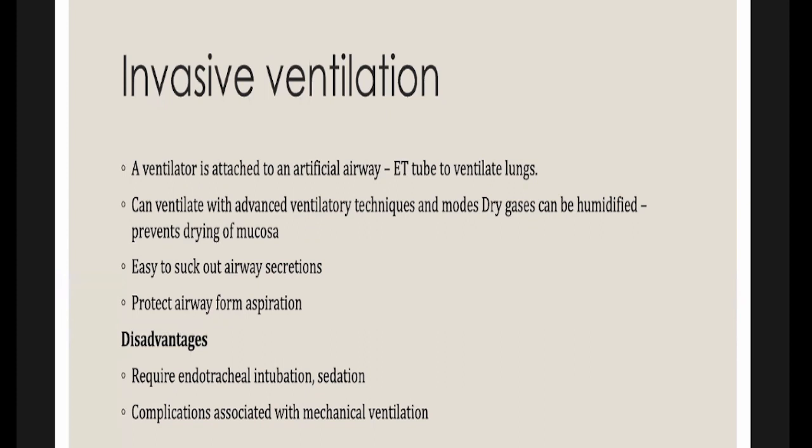So that's why we try to wean them from ventilators and take the ET tubes out as soon as possible. And also there are complications associated with mechanical ventilation, like pneumothoraces, chest injuries, and they can get barotrauma, volutrauma, atelectotrauma, and a lot of other problems. Okay, so those are the disadvantages of invasive ventilation.